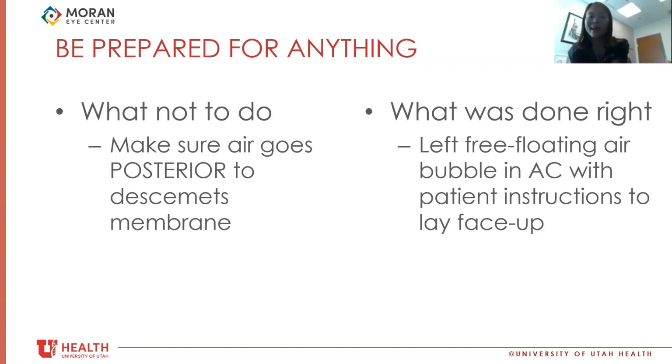So what I had been doing for a while was not going towards the center of the eye, but making sure I'm always very peripheral. So in case it does happen, I can catch it early. I suppose one could hydrate a little more superficially, and that might prevent this from happening. I don't have a good answer to that, honestly. So it's an N of 2 out of thousands of cataract surgeries.